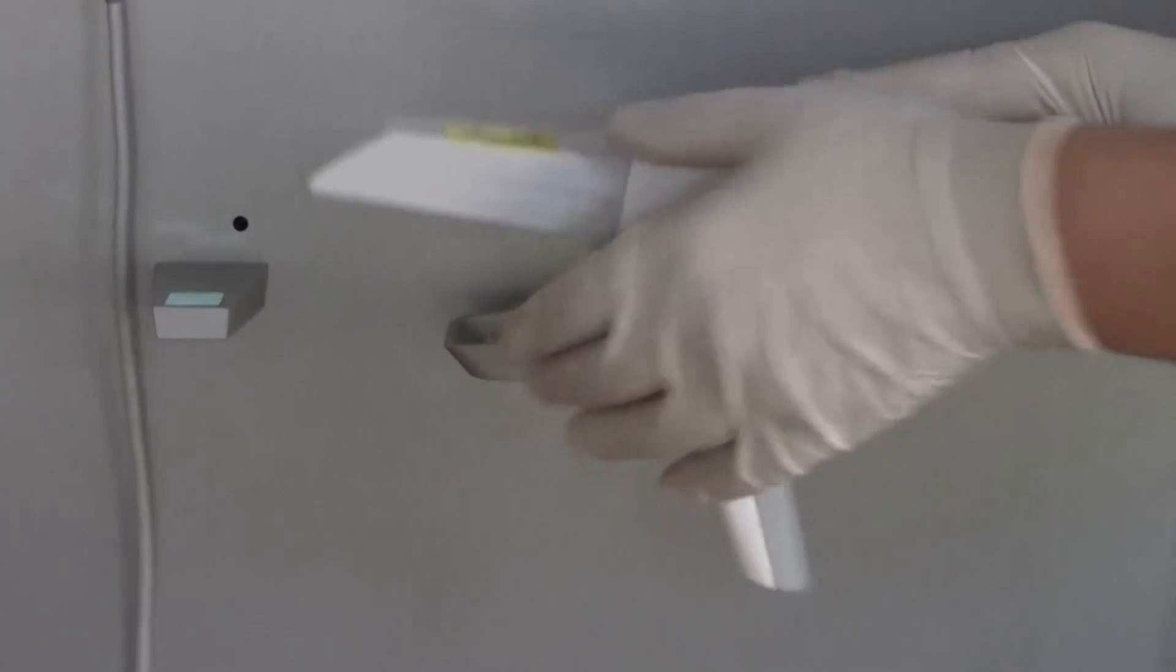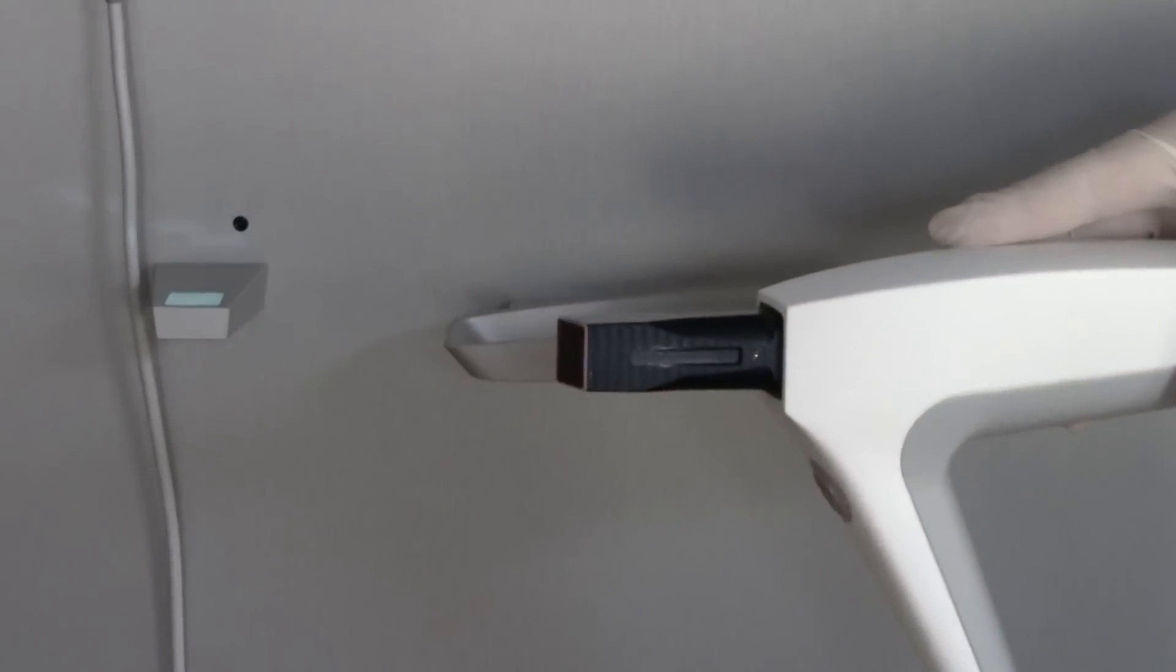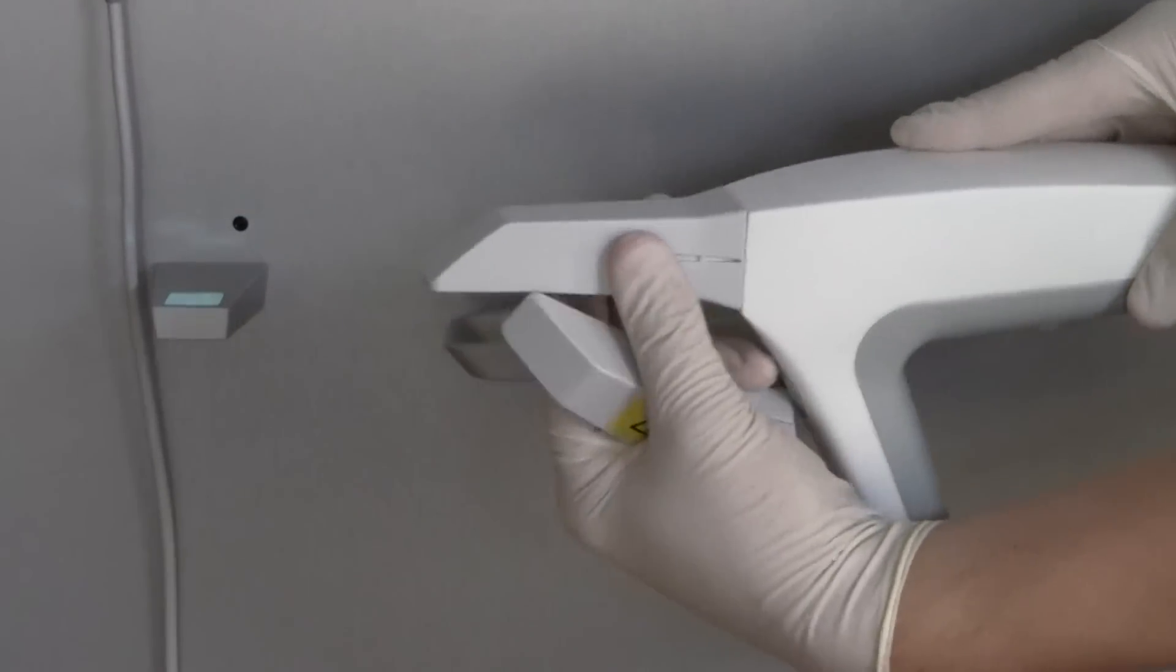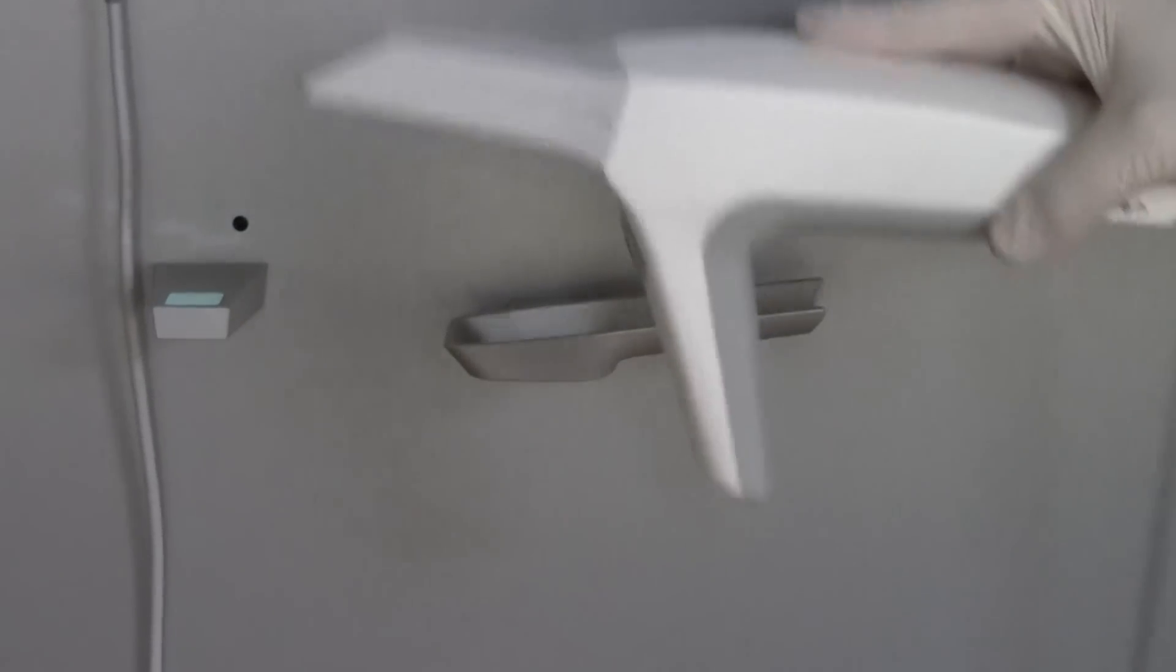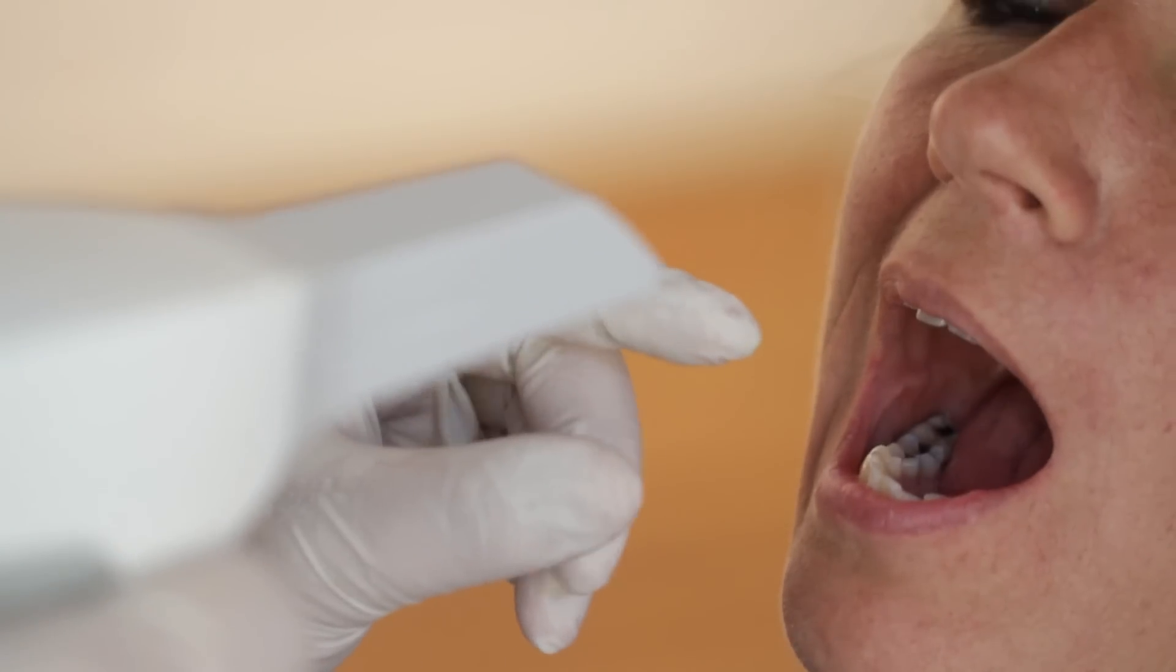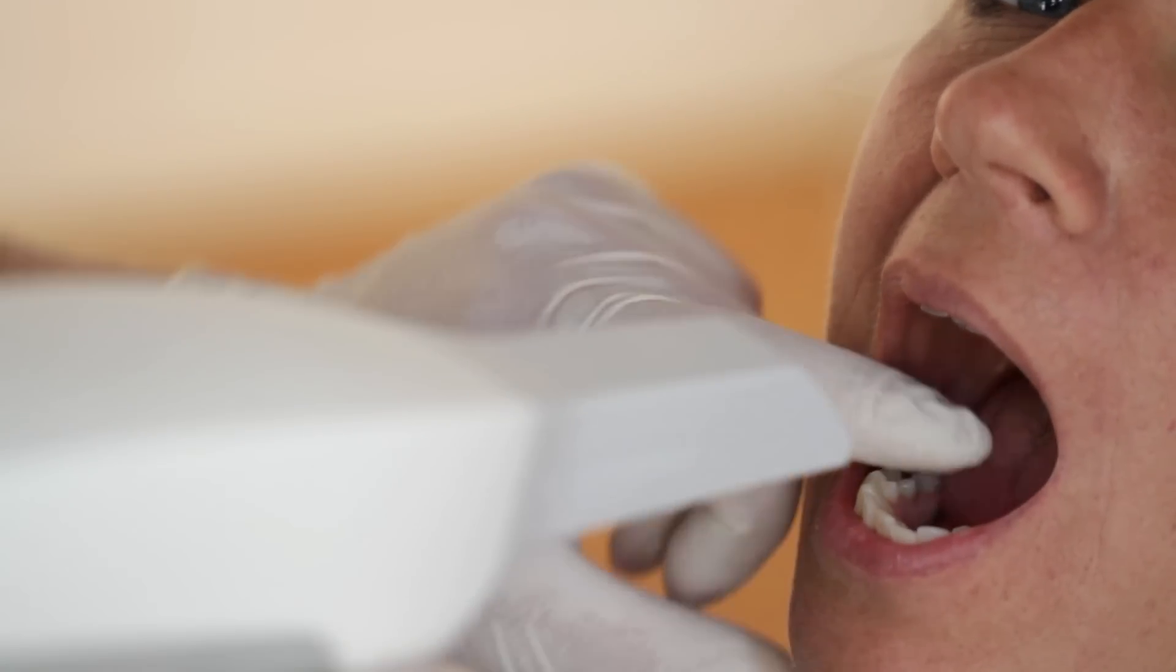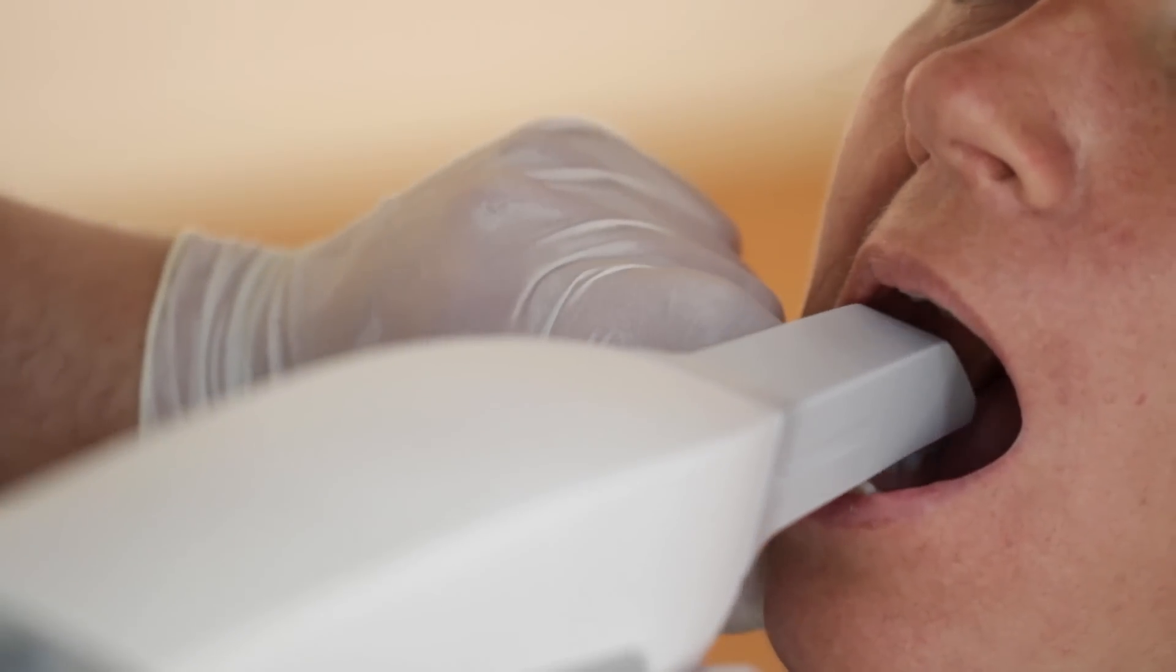The parking tip used during warming has a yellow label. Change to the scanning tip when ready to scan. Dry the teeth lightly with air and just start scanning. No spray is required.